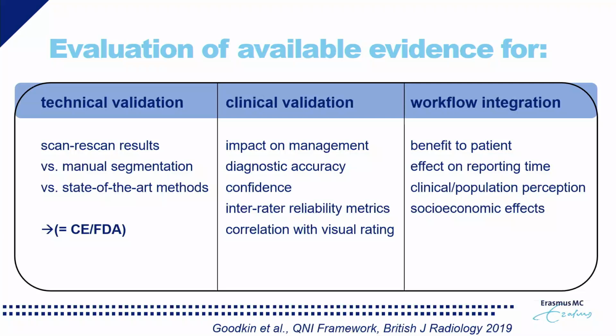The second step is clinical validation. What is the diagnostic accuracy in the patient group? How does it impact patient management? How does it influence the confidence of the radiologist or the physician? And then the last step should be validation of the software when it's already in use: validation of the integration into the workflow, assessing the actual benefit to the patient of using such software, how it affects reporting time, and how it is perceived.